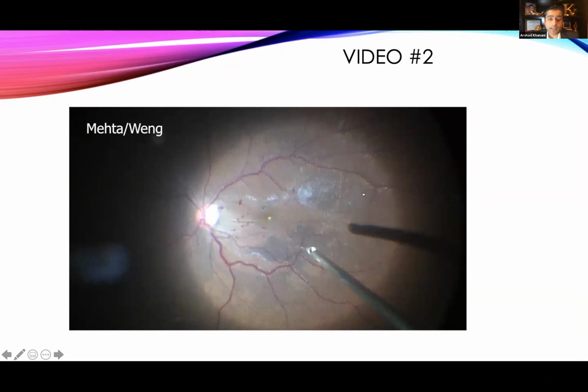My actual experience is that it does. I try to avoid Kenalog. I used to use it in all my cases. Now I'm like, okay, let's be more efficient. So if I'm not sure, I've seen some staining, some pooling on top of the vitreous. What do you think? And then I'll get to Carl. Yeah, I see it as pooling, but it doesn't actually stick to it. So it kind of just sticks to the ILM. Absolutely correct. So it doesn't really stick to the vitreous, so I find that to be not really anything I even think about for the most part. It just sits on it, it will tell you if the PVD is not induced, and you can kind of see it, but it doesn't really stain it.